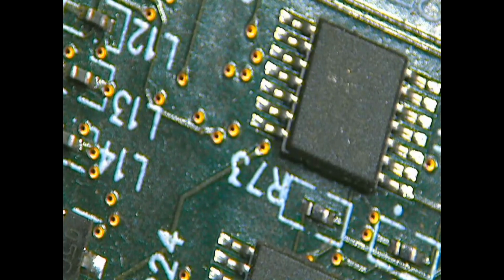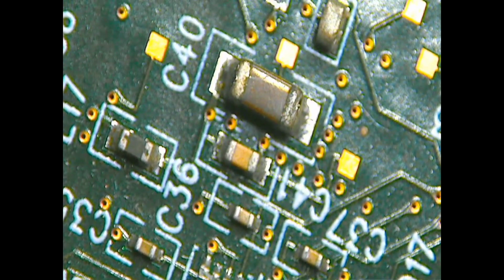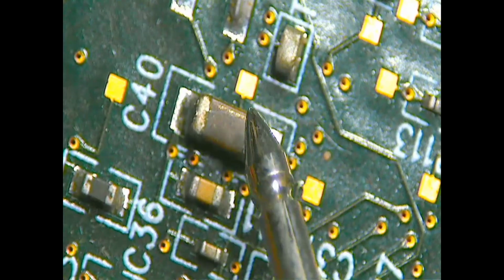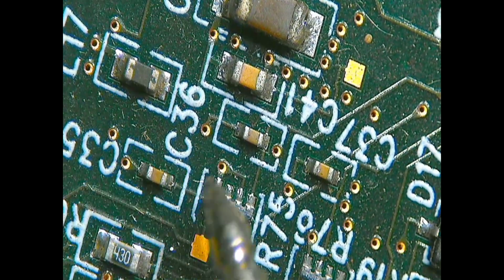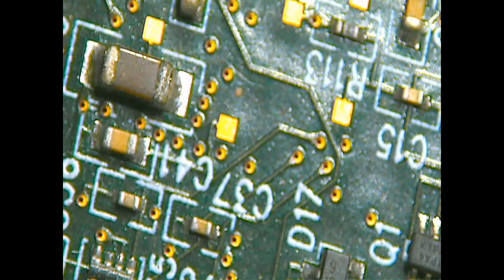Usually I'll go with capacitors and resistors first. So this time also I'm going with capacitors first. I can see some capacitors over here, and especially I have a doubt about this capacitor right here, because I can see some color changing using my microscope, and this one is also a capacitor. Okay, let's check these capacitors first. Put your multimeter into continuity mode and check it.